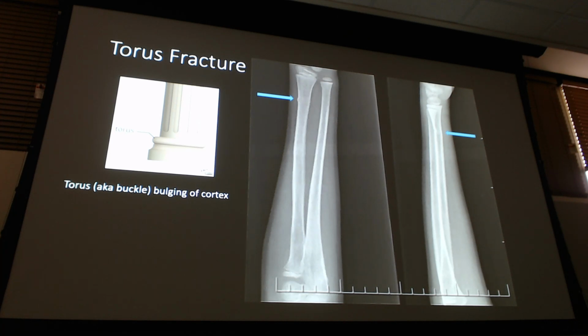So you have to look behind right here. Look behind and you can see it right there. Because they're overlapping, right? So the bone comes down and whoop, it's right there. Do I need the second one for diagnosis? I don't, because it's right here, right? We always get two to make sure we can look at it from different angles. But yes, right there. Nice part about toruses is usually you will find them on this regular AP image right here, this first one. It's not one that you often need this one to find it, but it's just showing you what it looks like.